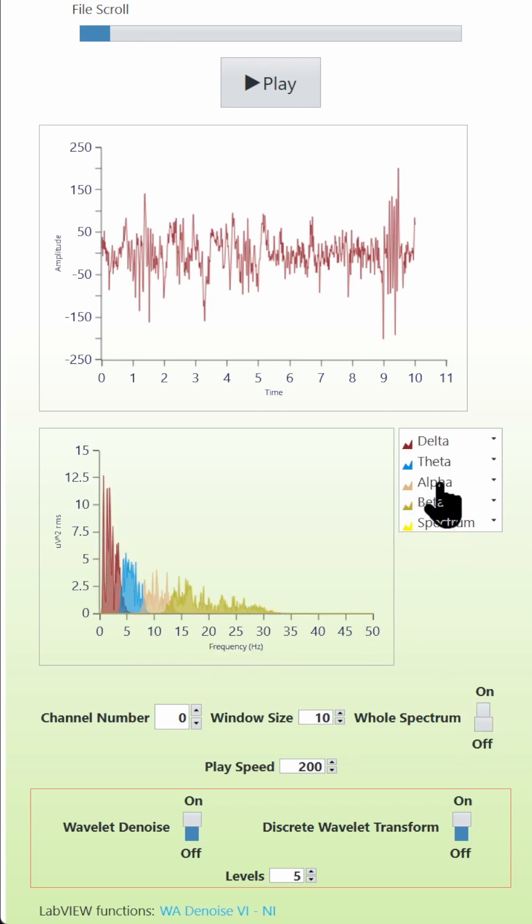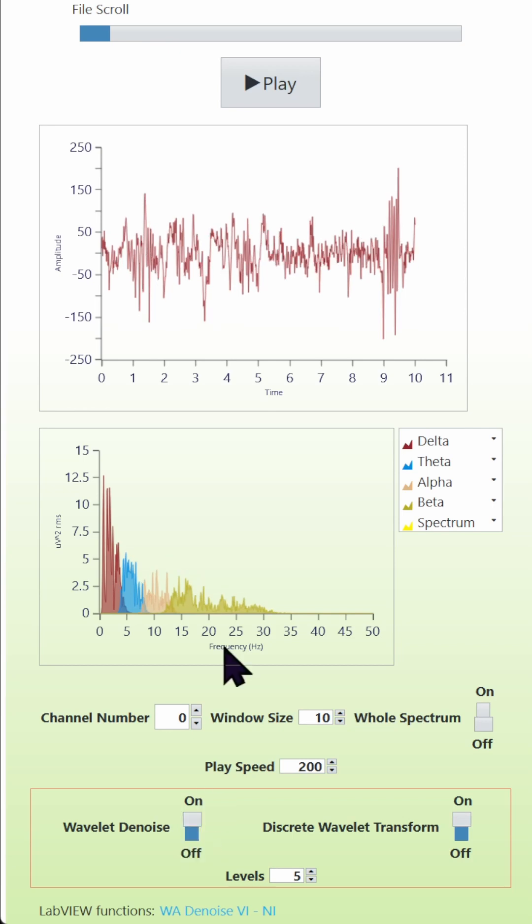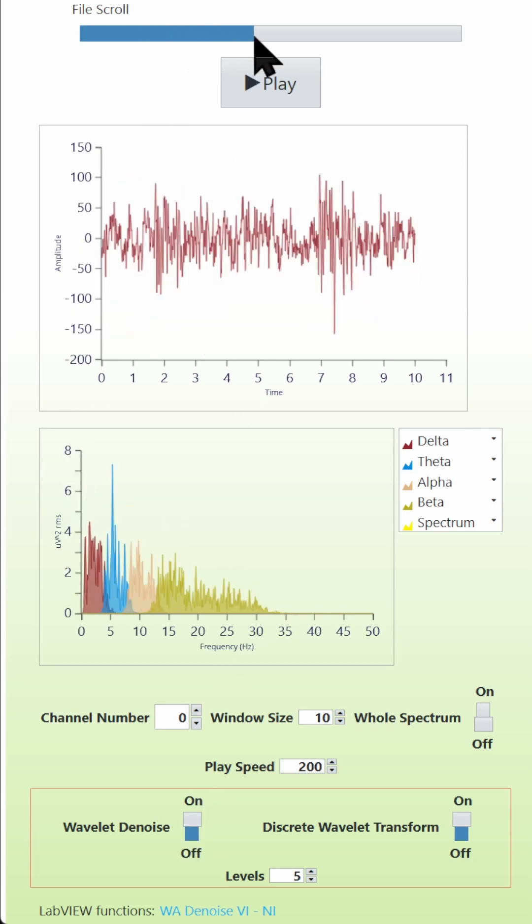The default is the four frequency bands: delta, theta, alpha, and beta, without an overlay. The main reason we are here is the wavelet denoise function, so you can turn it on and off to see how well it's performing.